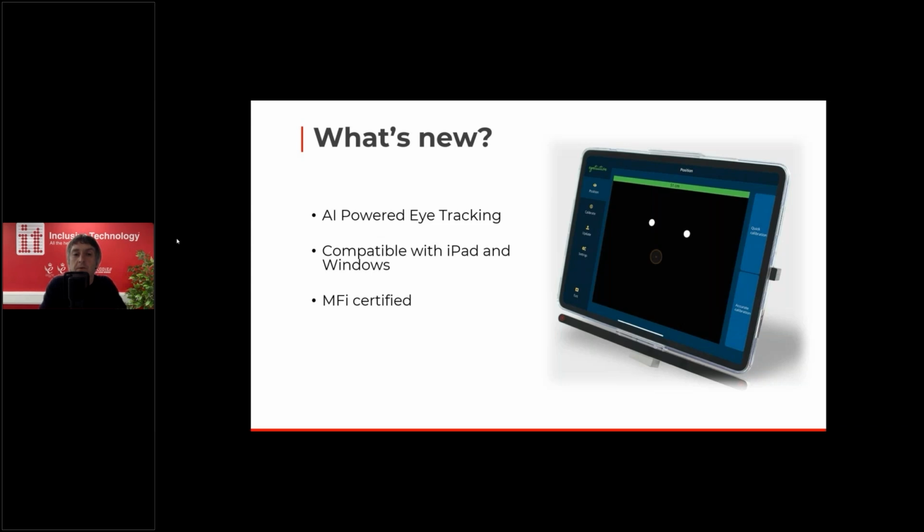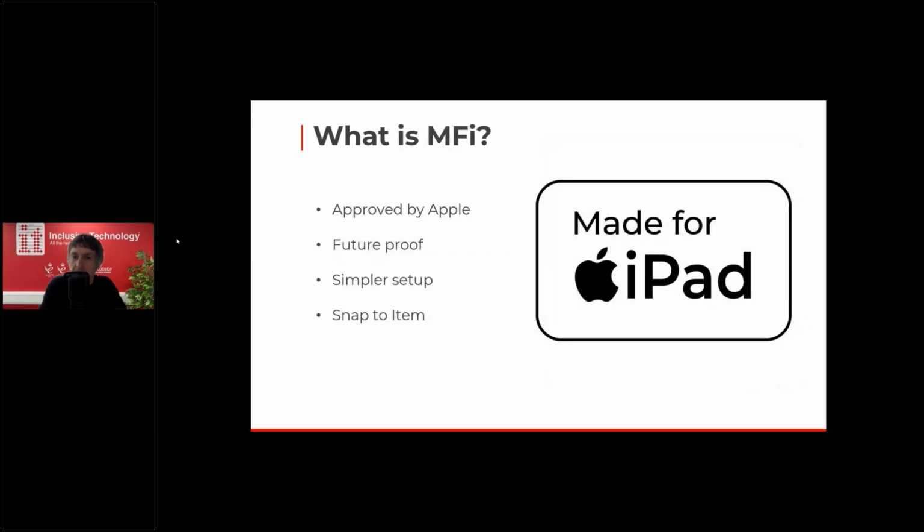Now, the final thing to mention about what's new is that Eyetuitive is MFi certified. So, what is MFi certified, I hear you say. Well, luckily enough, I've got a slide just to tell you exactly what it is. MFi means Made for iPad, so it's been approved by Apple. Every step of the design process of this eye tracker has been approved by Apple.